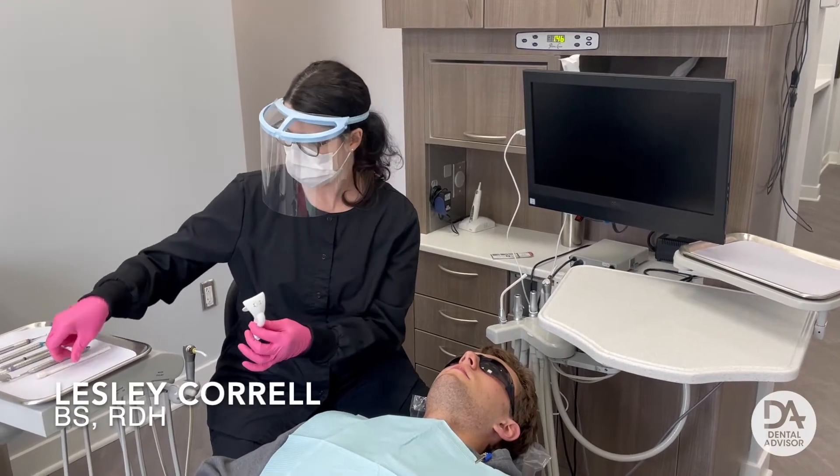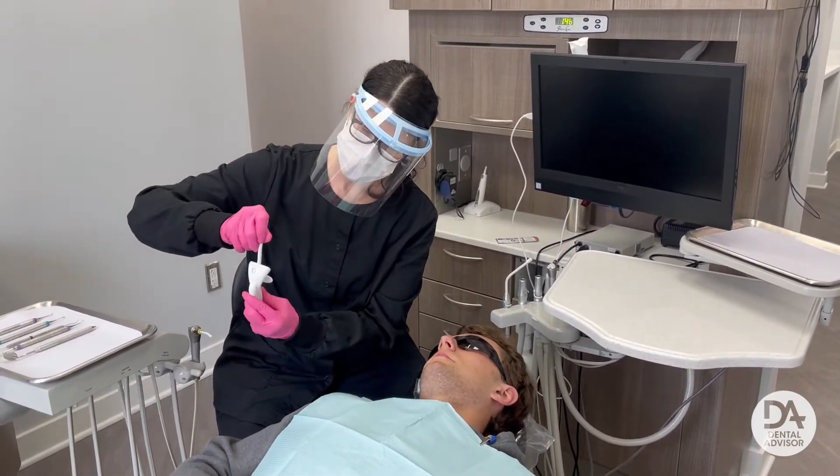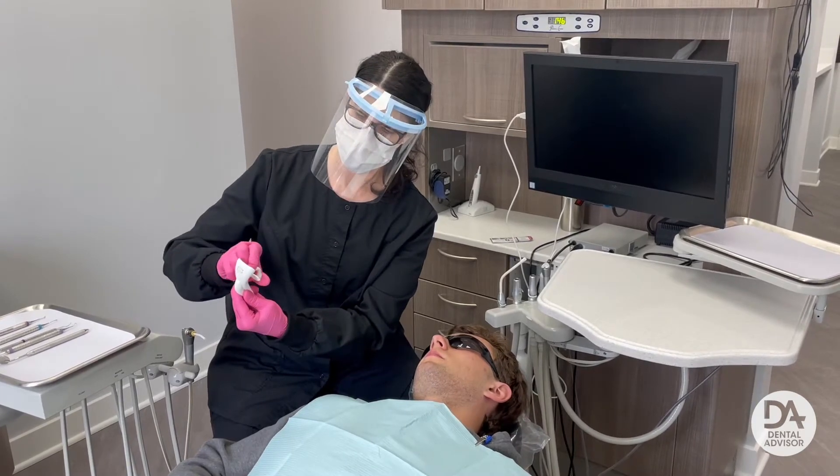Today I will be demonstrating the aerosol assist. First, take the saliva ejector and insert it all the way down. Click it into place and bend it so it sits comfortably in the patient's mouth.